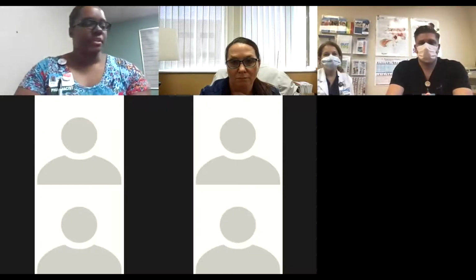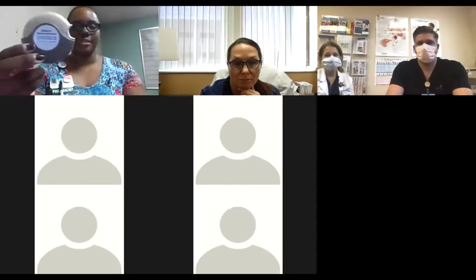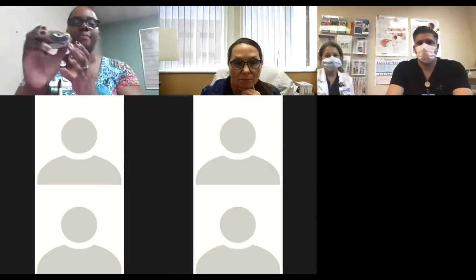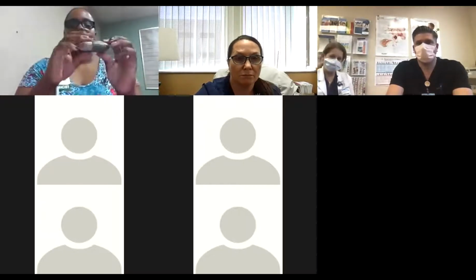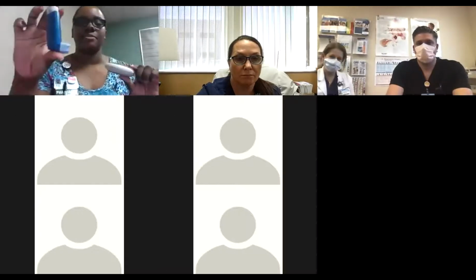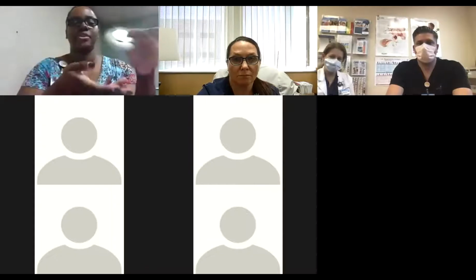All right, so the next type of inhaler that I'm going to demonstrate is this. It's called a Diskus. And with the Diskus, you would usually see your Advair. Typically, the Advair inhaler is the most common that uses this one. So I'm going to show you how to use it. One thing that's very important is this is a dry powder that is inside of here. So it's not like this medication that comes in a canister. It's very important that when you load the medication, which I'm going to show you in a second, not to turn it, because then you're going to lose your dose.